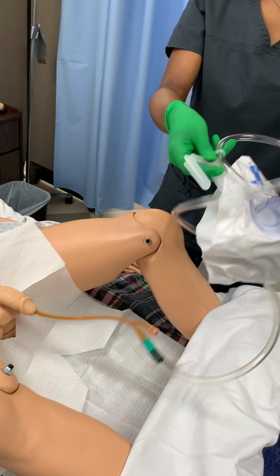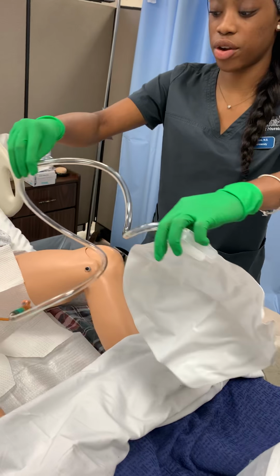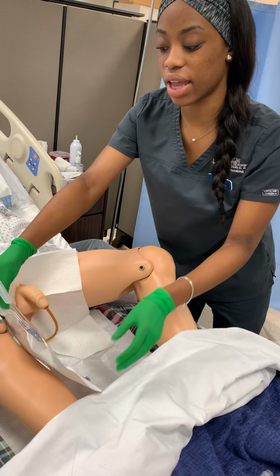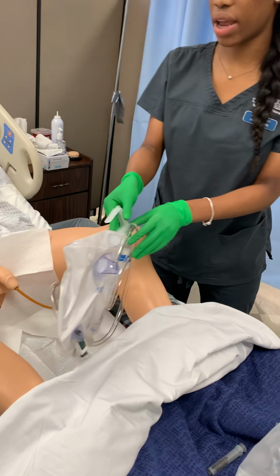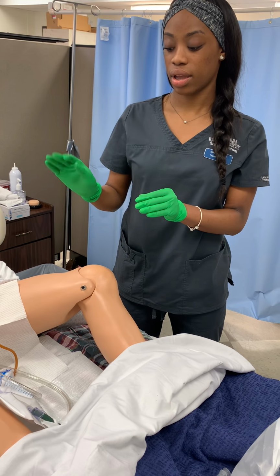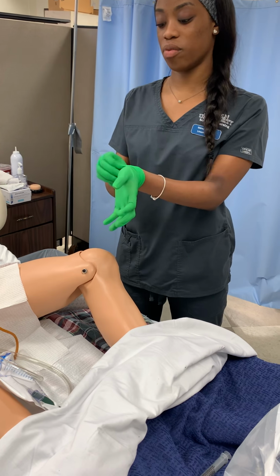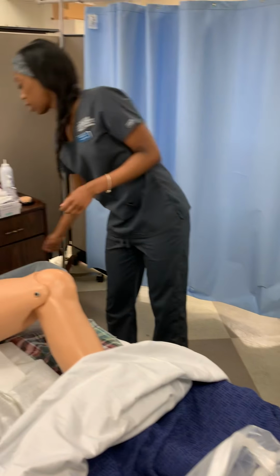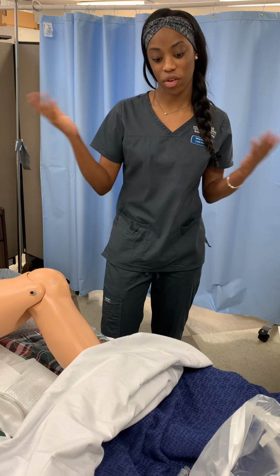What you want to do is untangle the rest of the catheter, and either place it on the inside of the patient's leg and tape it, or place the catheter on the side of the bed. Now I'm going to date and name the catheter, and document what I see. Then I remove my sterile gloves and wash my hands, and that's how you insert a Foley catheter.